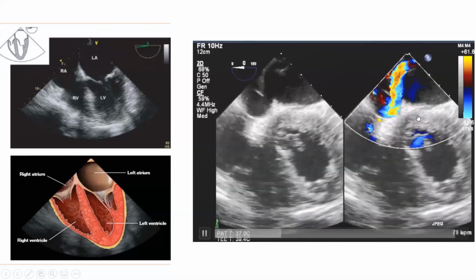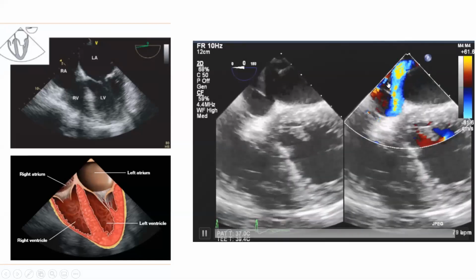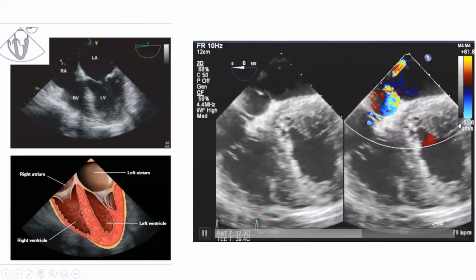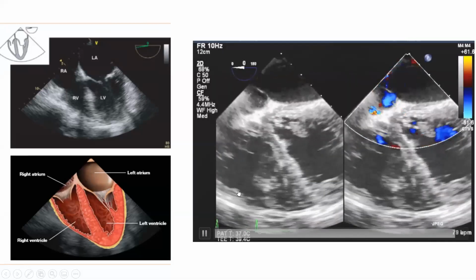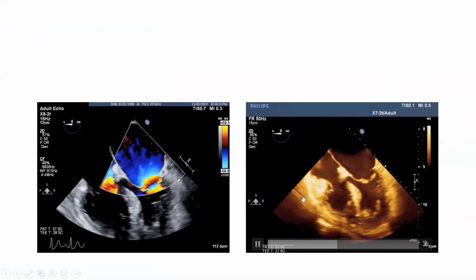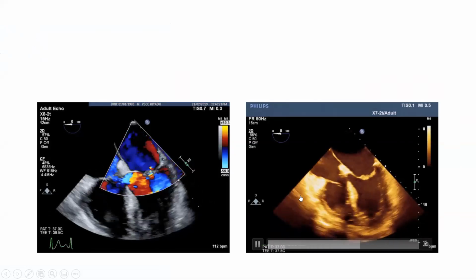If it is coming from this view, coronary sinus view, or posterior or deep mid-esophageal view, it will be A3, P3. Okay. So again, whenever you lose or you cannot get the view, go to the baseline view.